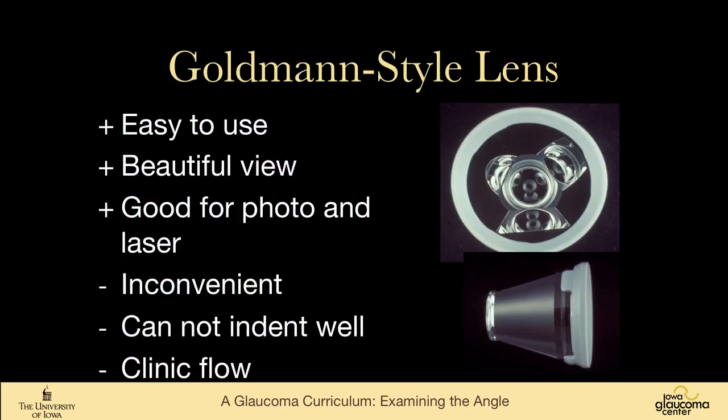So the Goldmann-style lenses are easy to use, beautiful view. They're great for photography and laser. So if I'm doing a laser procedure in the angle, I always use a Goldmann-style lens, or many of them that are designed specifically for laser use. Or when I want to do videography for my website on gonioscopy, I would use a Goldmann-style lens. But they're less convenient. They can't be used really to do indentation with any sort of power at all.